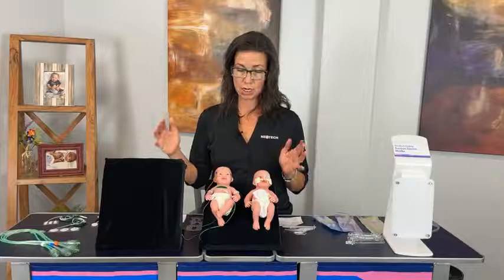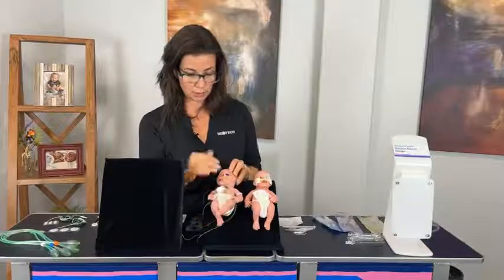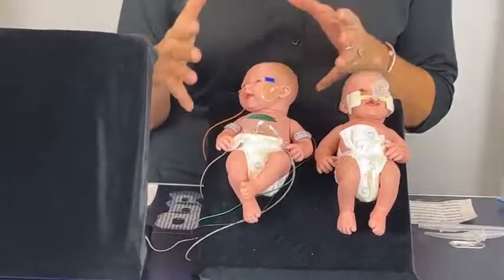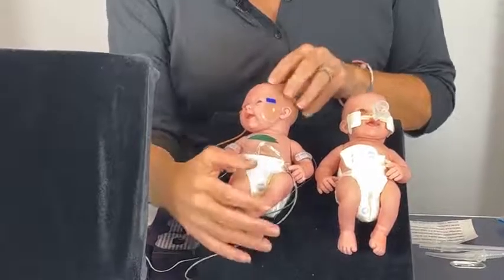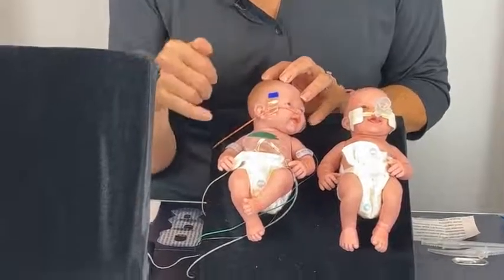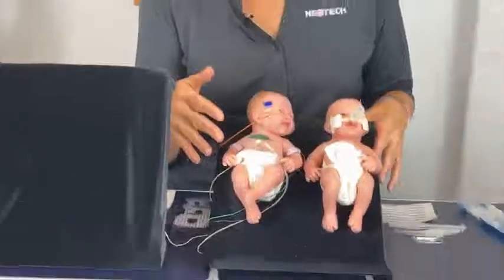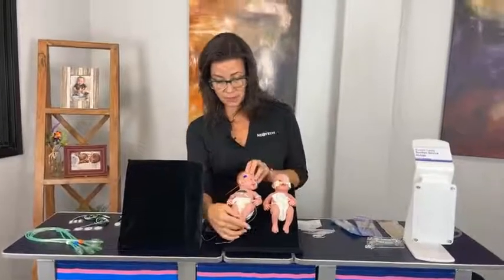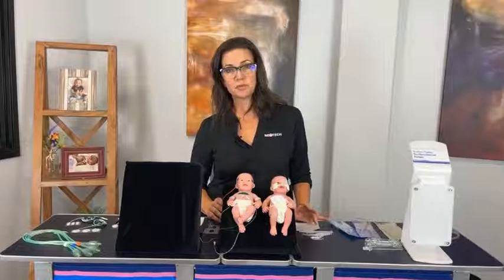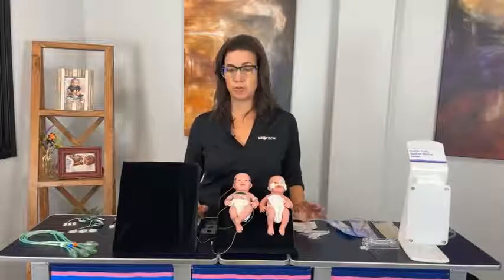If you happen to catch our last live episode on hydrocolloid products, you might recall that we demonstrated the Easy Hold cannula holder. We demonstrated the standard size. You can see that it's huge on a micro preemie. It's really close to his eye, which we don't want. And on this side, we have the Easy Hold Mini. Now this product has been designed for babies of his size. This is the same skin-friendly Neobond hydrocolloid product. It is just smaller. Since we did go over application last time, I'm not going to demonstrate it today. If you'd like to go over application and removal of the products, please revisit our hydrocolloid episode. You can find it right here on our Facebook page or our YouTube channel.